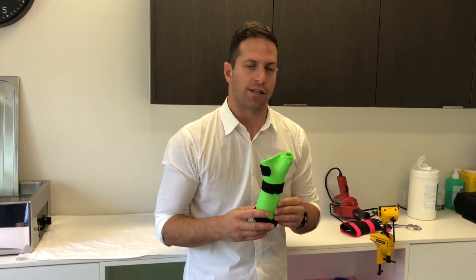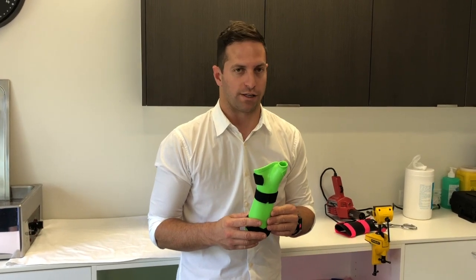Hi, I'm Damien from Advanced Therapy Solutions. Today we're doing a wrist and thumb splint to treat De Quervain's tenosynovitis.